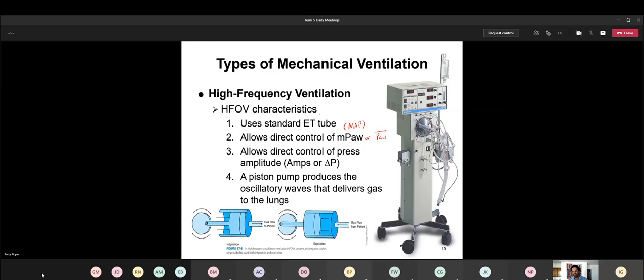So that means that with the B model, you could ventilate babies or adults. But with the 3100A model, you can only ventilate the babies and the smaller kids. You can't really do much with the adults with that. And all it comes down to is the maximum settings that can be achieved.